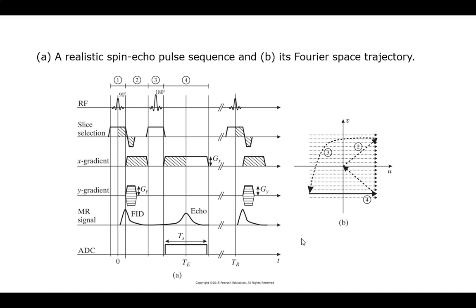So again, RF pulse, it's got to be synced. Whenever you see the RF, you should see Z. You can see Z without RF, but not the other way around. I select my slice, head to toe range. And they're both activating, so I'm going to move diagonally.